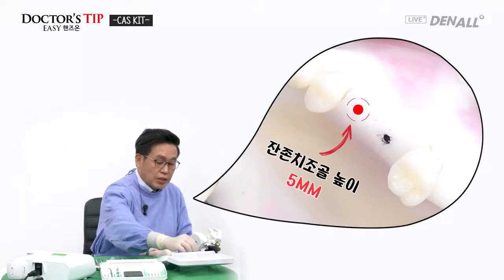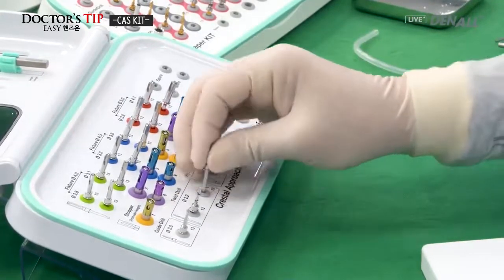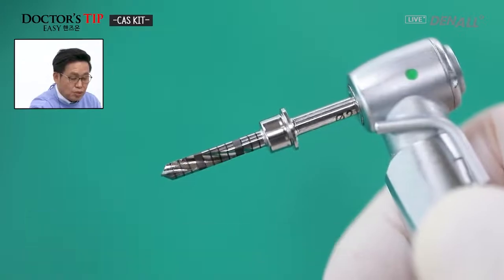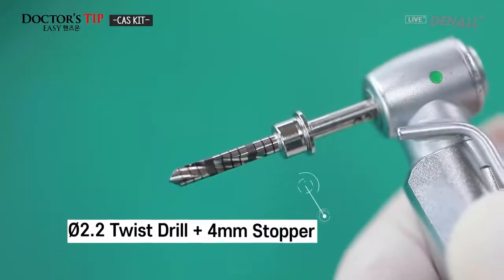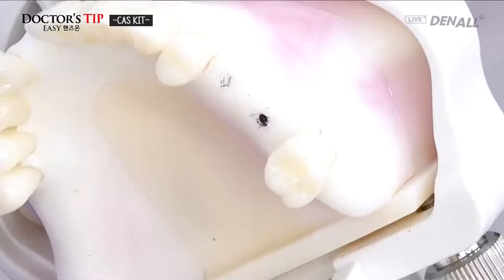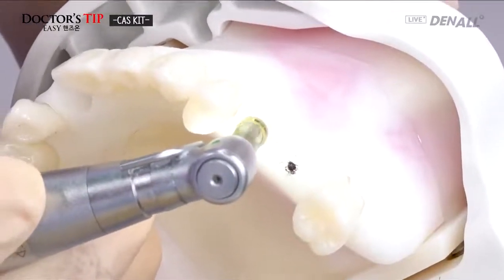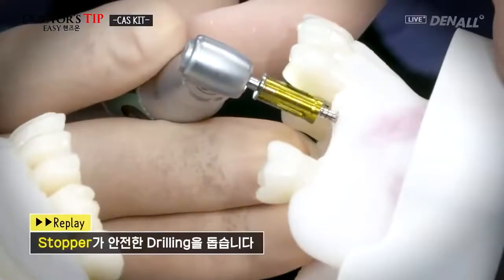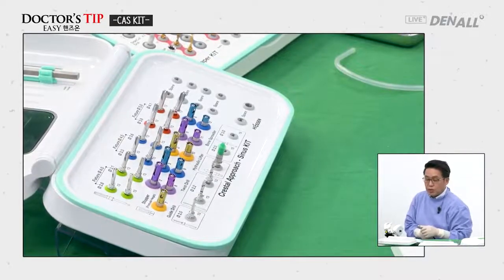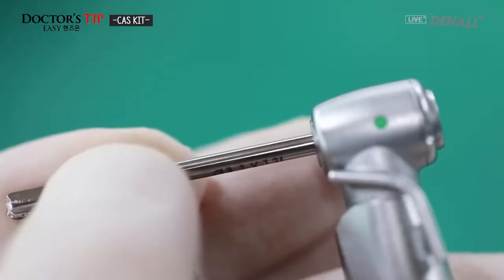And number 25, on the X-ray, the residual bone height is 5 millimeters, so the twist drill is chosen. The remaining bone height is 5 millimeters, so 1 millimeter under-drilling is to be done. So a 4 millimeter stopper is used. The 2.2 twist drill. At 25, a 4.5 millimeter fixture will be installed. CAS drill, diameter 3.1 is chosen.